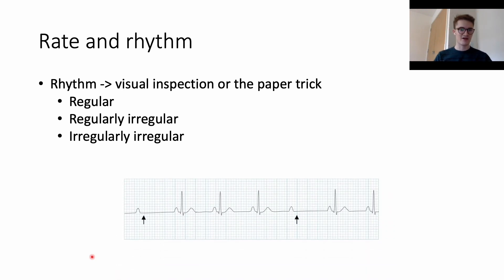This is another example of a rhythm strip. By visual inspection, I would look at that and say I'm not quite happy that that's regular, because we've got these gaps here which look about three and a half large squares across, and that looks quite regular there. But then we've got a large gap here where there's no QRS complex, so we've got a large gap between these two QRS complexes of seven or eight large boxes.